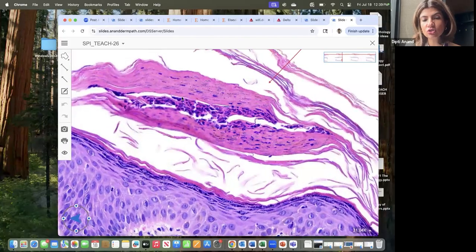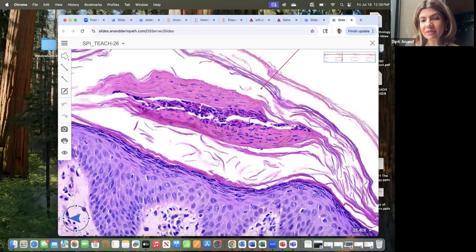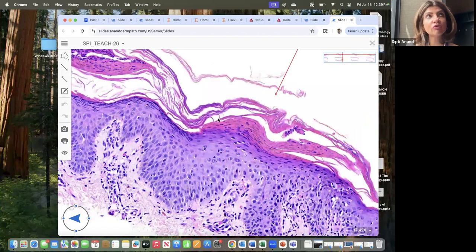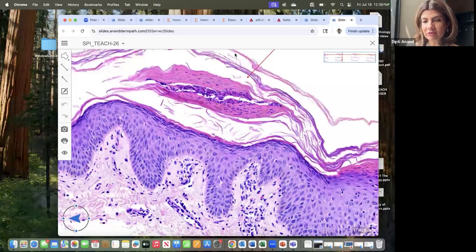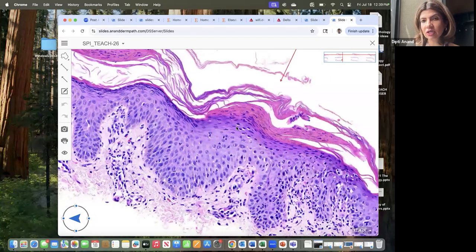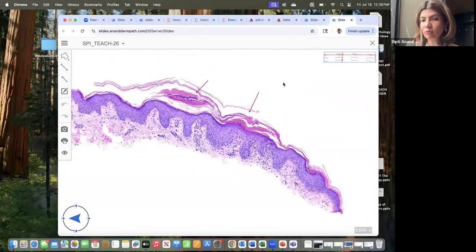Because it has the neutrophils besides the parakeratosis. You see the neutrophilic debris besides the parakeratosis, and that makes it a dirty mound. And this is a stuck mound, because the mound of parakeratosis is stuck directly to the epidermis with loss of the granular cell layer beneath it. So this is a dirty mound and a stuck mound. That is very pathognomonic for guttate psoriasis.